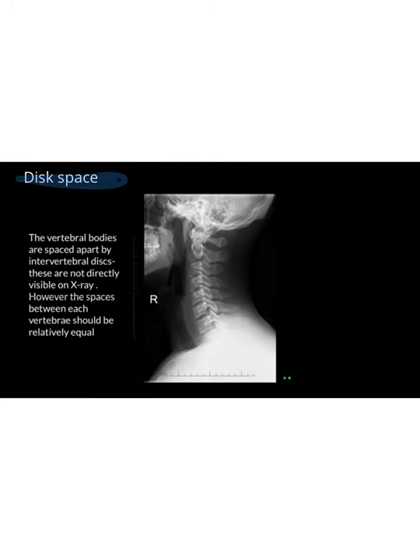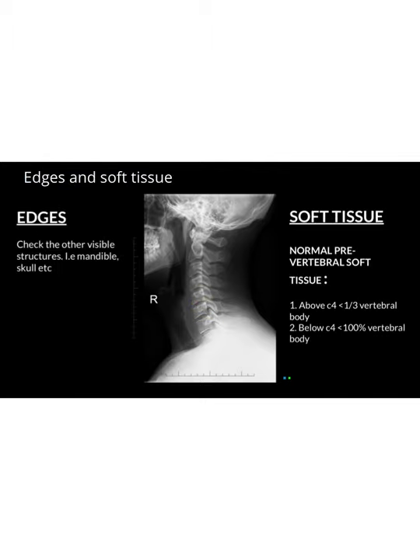D is our disc space. Intervertebral discs are typically difficult to see on x-ray, but we look between each vertebra to see if the spacing is relatively even. E is our edges and soft tissues. For edges, we look for fractures of surrounding bone like the cranium and mandible. For soft tissues, we look at normal prevertebral soft tissue: above C4 it should be less than one-third the width of the vertebral body; below C4, less than 100% of the vertebral body width. Any enlargement may indicate a prevertebral hematoma.